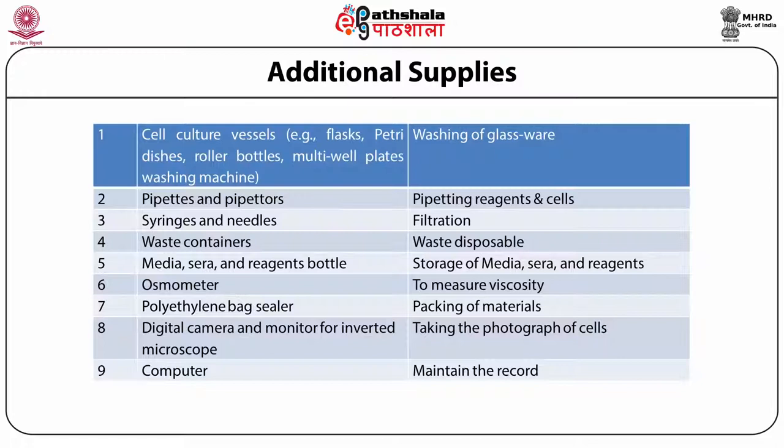Syringe and needle filter. These are required for filtration of certain heat labile components which are utilized for animal cell culture technology. Waste container. You cannot discard the waste anywhere, so waste should be discarded into a particular container. This should be autoclavable if the facility is available in your laboratory, to produce better results.